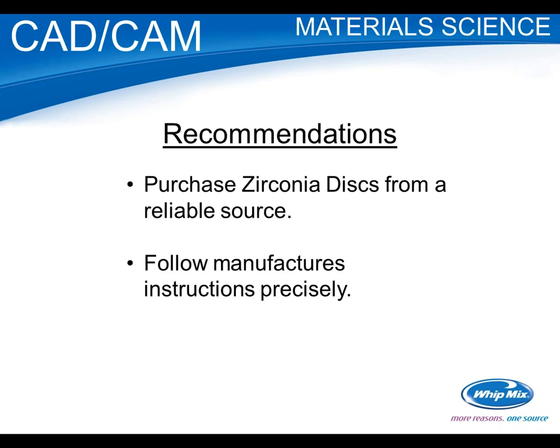The other is, again, as a manufacturer, I always harp on this, is follow manufacturer's instructions precisely. As a consumer, I'm as bad about this as anybody else. You know, I'm a typical American. I just jump in and try and make things happen. But since this is new and really these materials are different, I'd strongly suggest looking at the manufacturer's instructions. And again, my big thing is don't overfire. You can just do so much damage to a really good product.